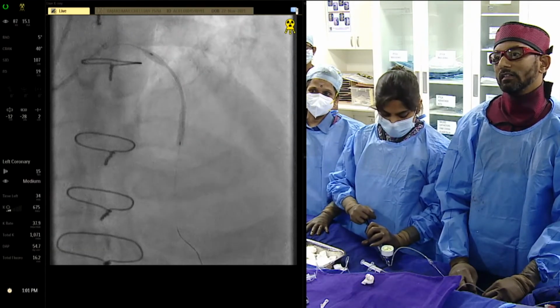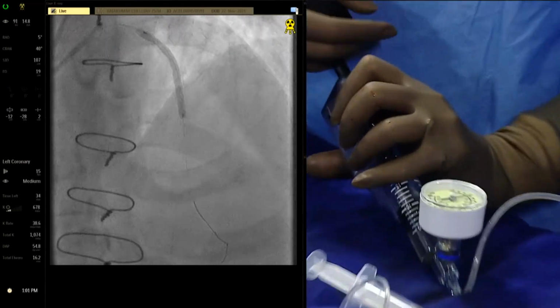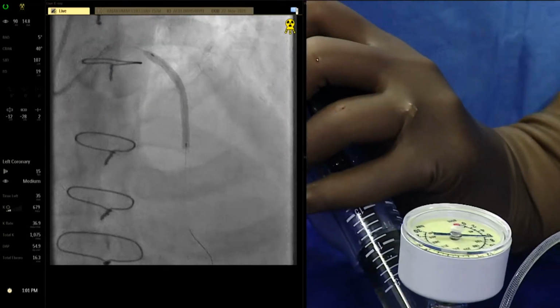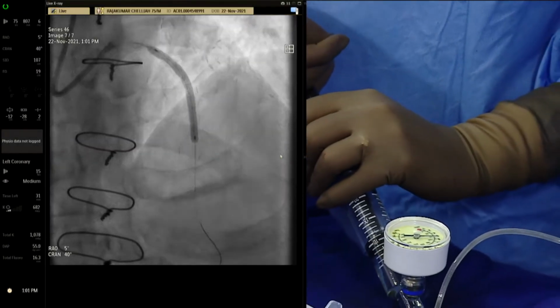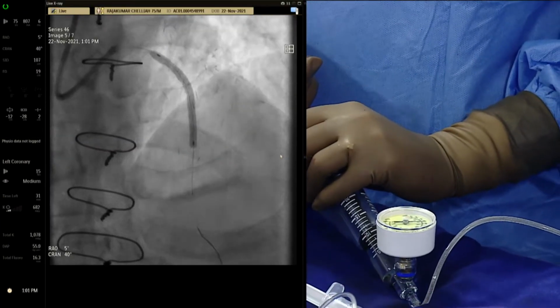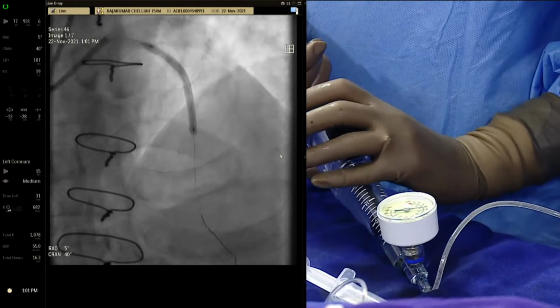I'm waiting at 6 now. Yeah, at 8, 6, 8. 6, 8. That's it, keep it at 8 because distally I don't want to go. Leave it to. So 3.5 you see. We definitely need a 4 to expand at the top. 8 is there. Distally down. Yeah, down.